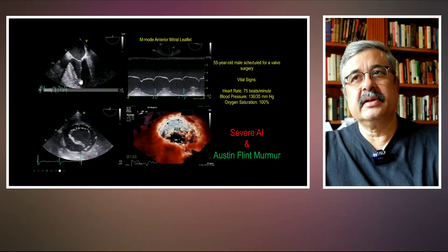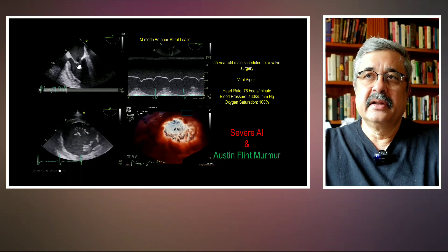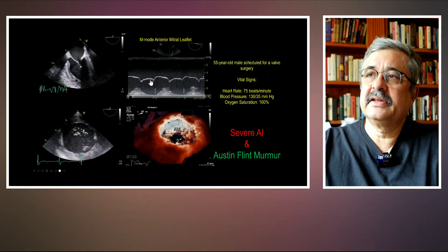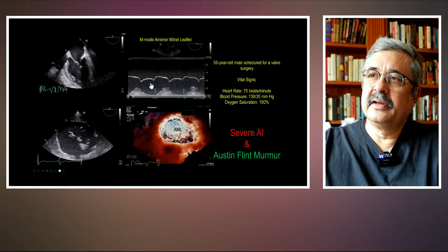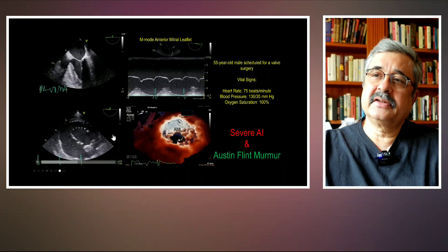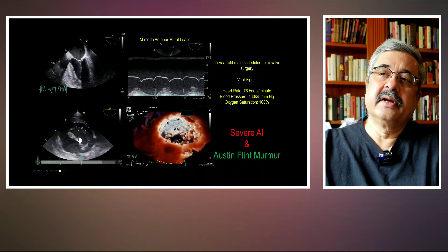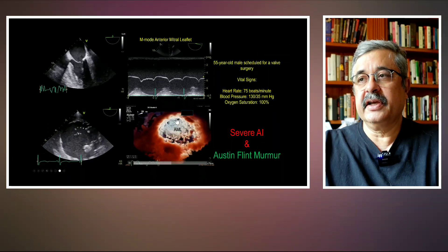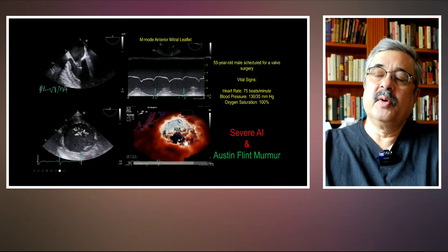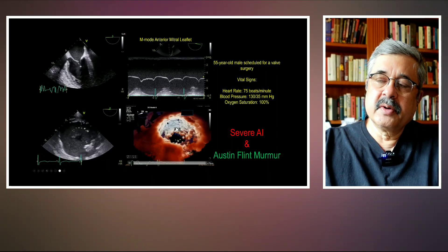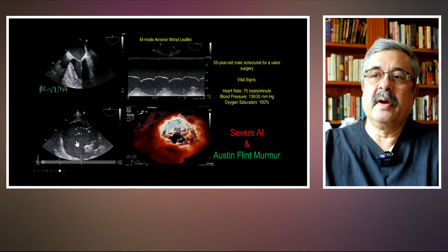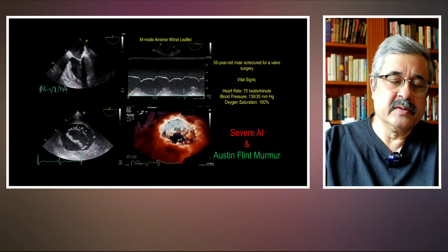In the mid-esophageal four-chamber view you can see the fluttering of the mitral valve in diastole, which can also be appreciated on the M-mode through the mitral valve. During the diastolic phase you can see this high-frequency fluttering, very well demonstrated in the basal transgastric short axis as well, showing the anterior mitral leaflet fluttering in diastole. The three-dimensional rendition shows the same thing more elegantly, illustrating the direction of the eccentric aortic regurgitation jet.